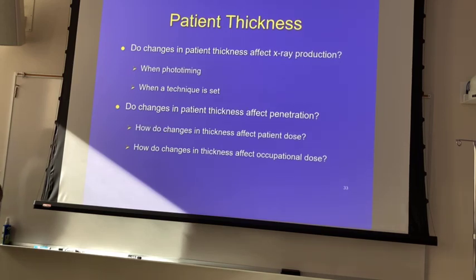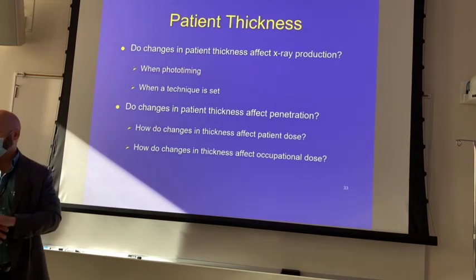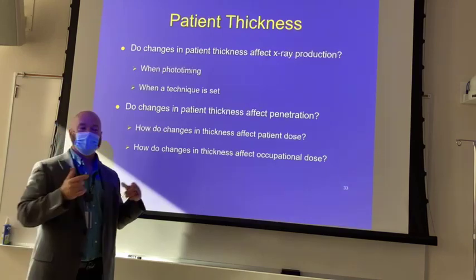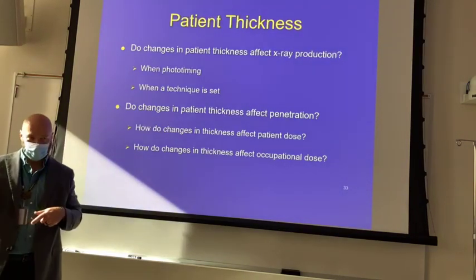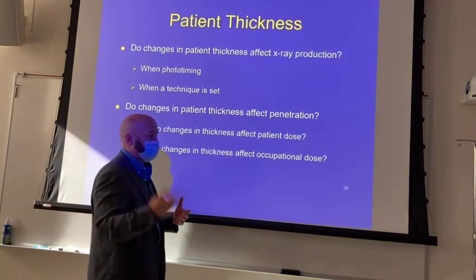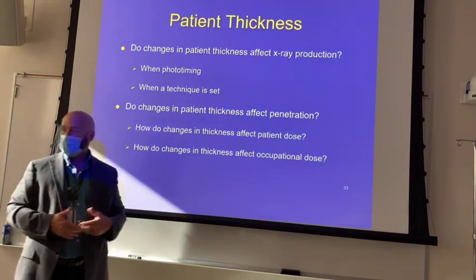Okay. What do you mean by it'll overexpose? It'll shut off later. Yeah. It won't overexpose the patient or the image receptor. It's just going to continue to roll. The detector is going to continue to roll until it gets the adequate exposure.